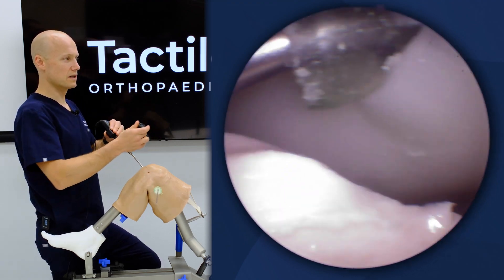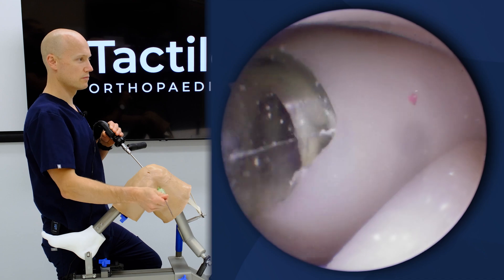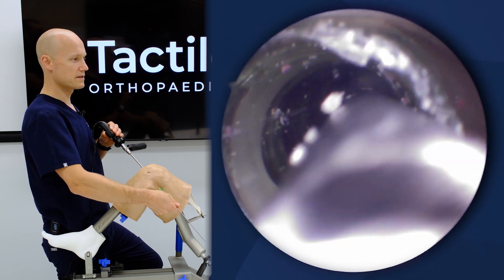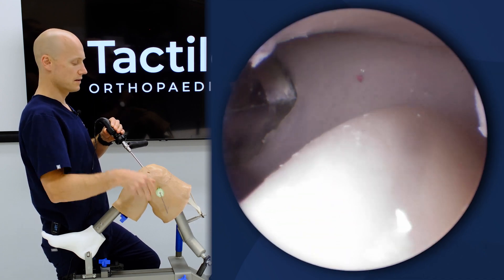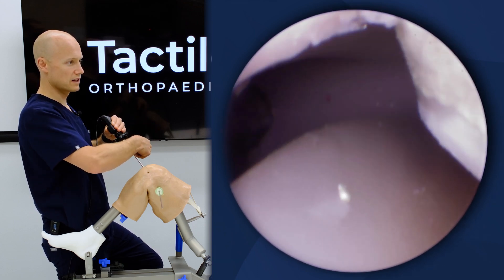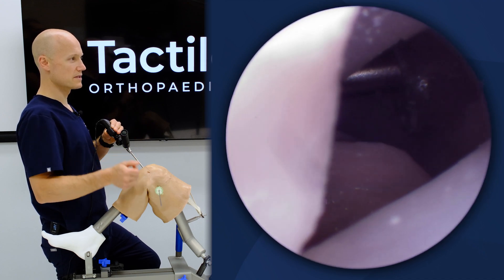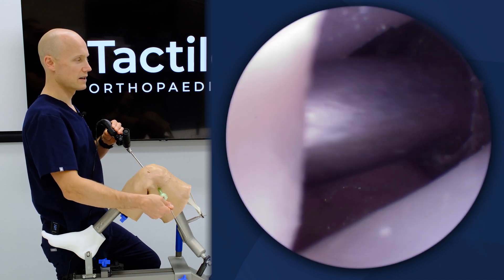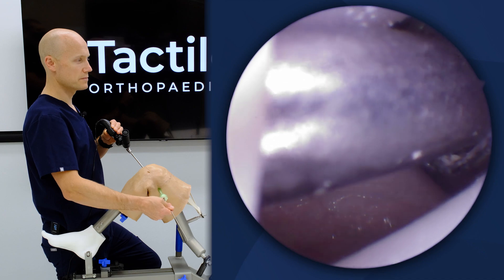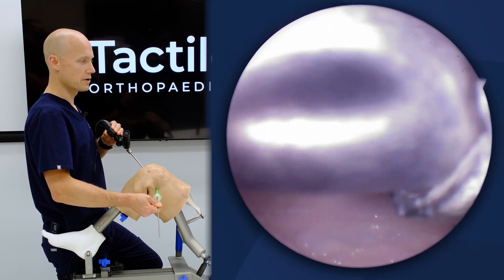Once I'm in with my cannula, I can probe different aspects of the meniscus. I can also back up and see that junction point between the posteromedial meniscal root, some septum, and the PCL in the back. I can push until I hit the PCL, then fall a little bit more posterior and punch across.